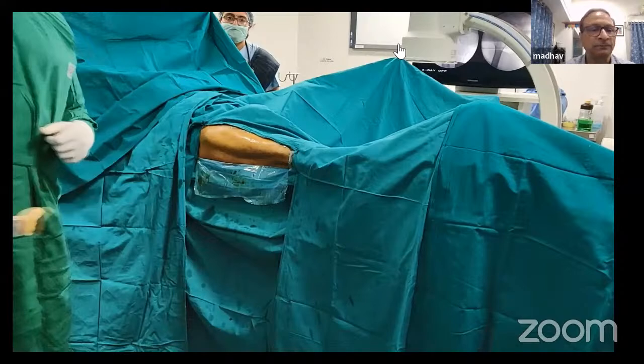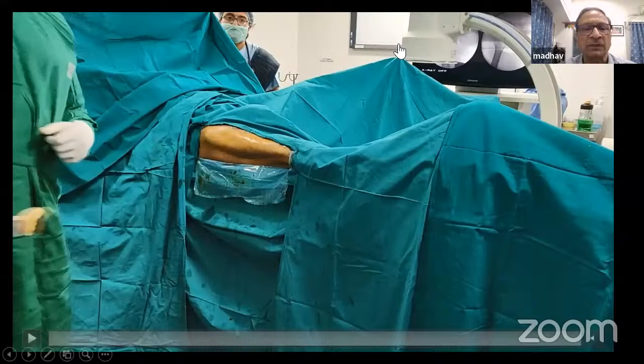Thank you. So this was draping of a patient on a fracture table.